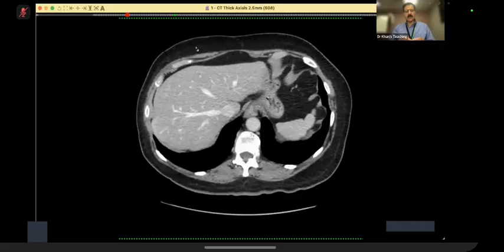And by the way, now we use hepatobiliary specific contrast. Just remember the main physiology and you can work out the pathophysiology. If there are normal hepatocytes, it will show high uptake on the hepatobiliary phase. A HCC will not have normal hepatocytes. A metastasis will not have normal hepatocytes.